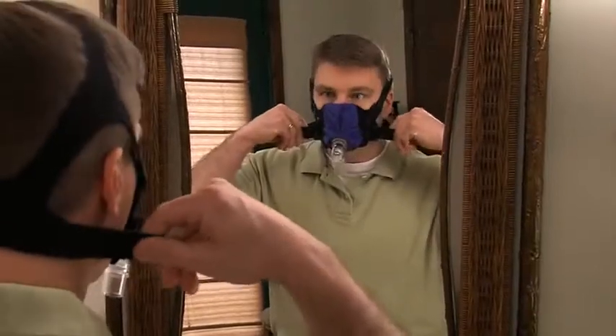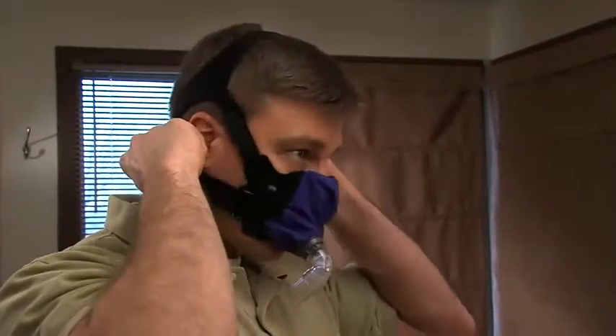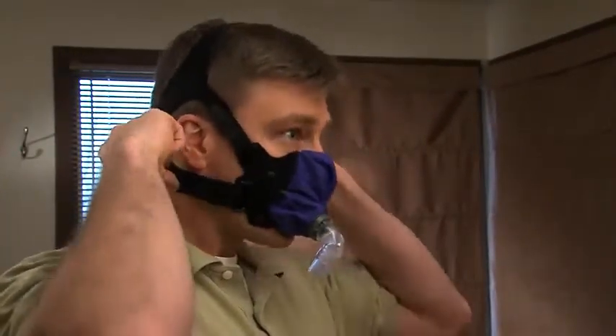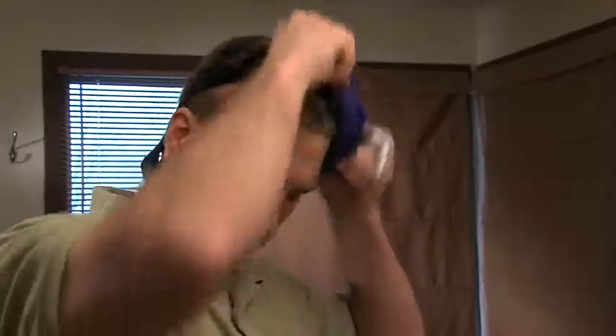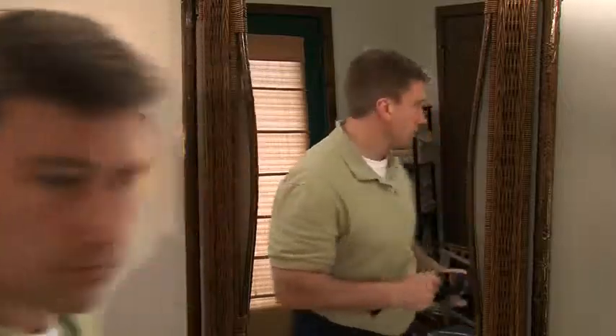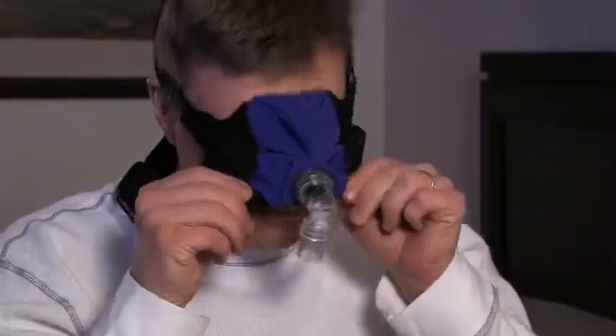It is recommended that you practice putting on and removing your mask in a mirror before your initial night's sleep. The SleepWeaver Anew soft cloth PAP mask was designed with two quick release clips to help you remove the mask quickly. Practice removing the mask by disconnecting only one of the quick release clips and pulling the mask over your head.